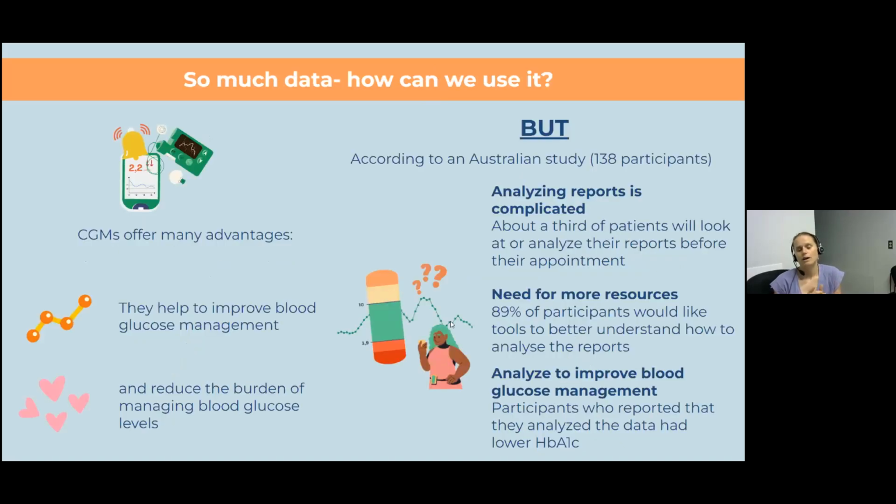So now that we actually have quite a bit of experience with CGMs, they've been out for many years now. And they offer many advantages. As clinicians, they really help us in following and adjusting therapy to optimize glycemic control. But also for the people who wear these devices, it helps them on a daily basis to reduce that burden of managing their blood glucose every day.